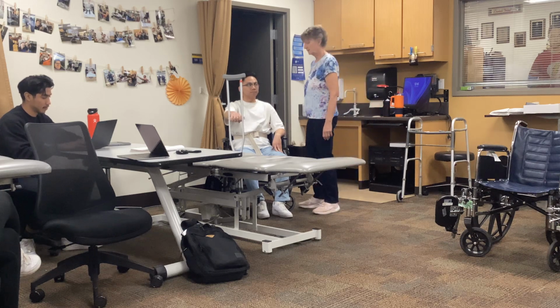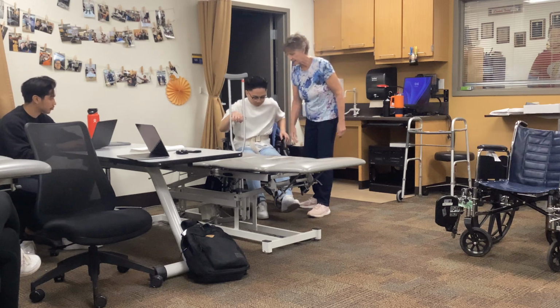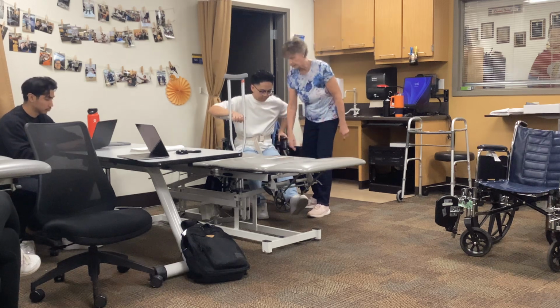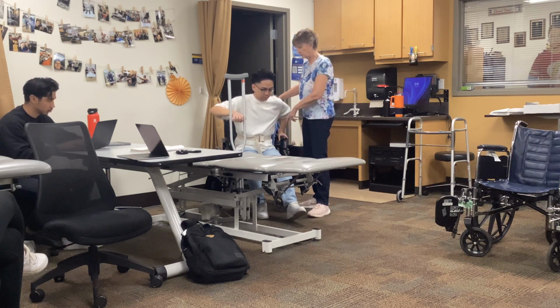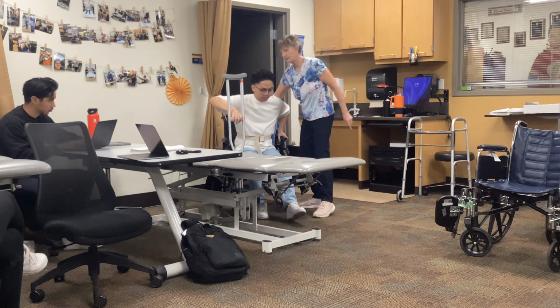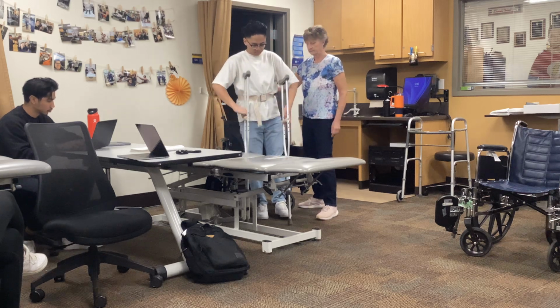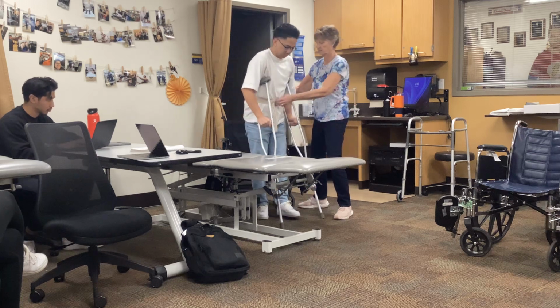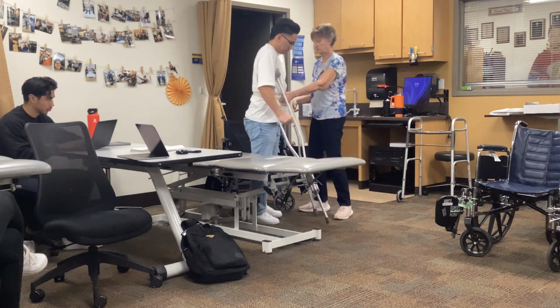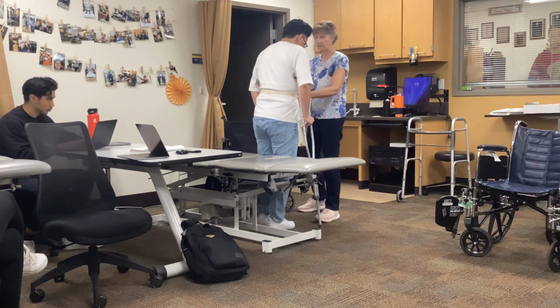All right, so same way to stand up, kick that leg out. We'll make it partial weight bearing this time, but we're still going to kick it out to stand up, push forward, push down on there, push to stand. And he's going to turn this way so that his bottom faces the back of the treatment table, and back up till he feels it.